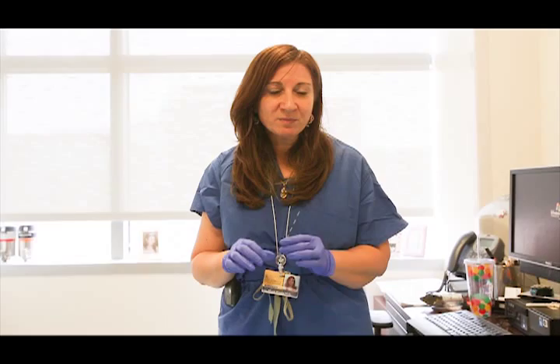I'm Dr. Hanna from the pain service. We've had a lot of epidurals coming out recently because of wrong taping, so I'm here to tell you the best way to tape an epidural catheter on the patient's back. By the way, the SORB-A-View by itself does not work — this is how most epidurals come out before time. Please do not use SORB-A-View by itself. I'm going to go through the process one by one to show you how to tape the epidural.